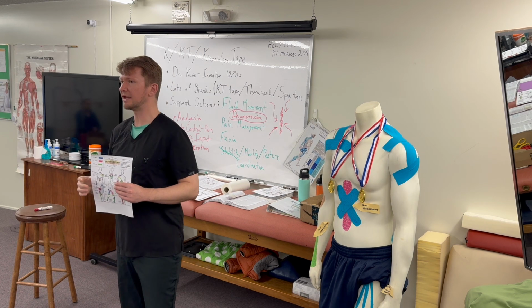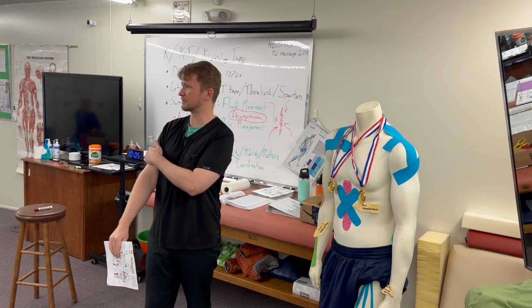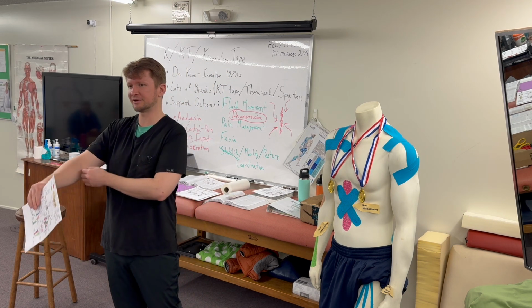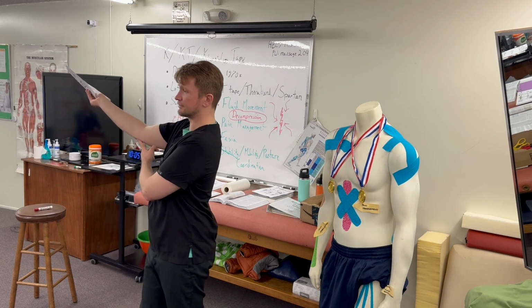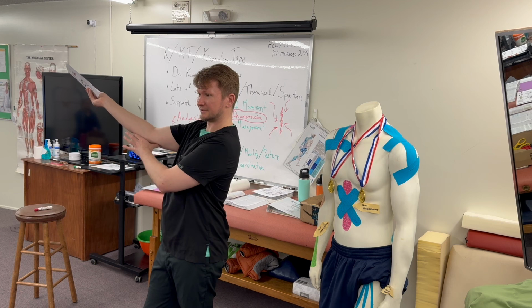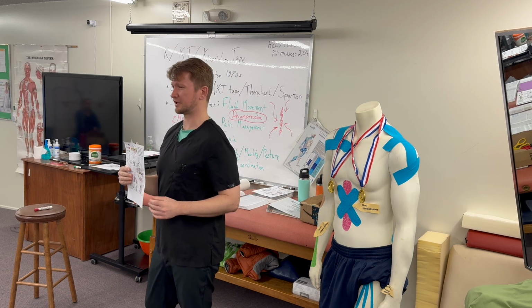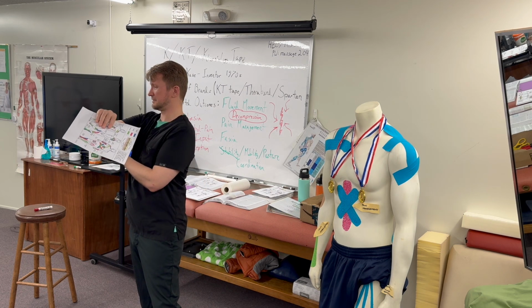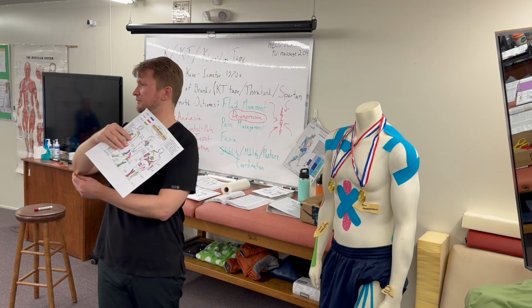So you may find somebody that has what we'll call a hot spot. Maybe there's an area with superficial nerve damage. I've used it when I had any kind of ulnar nerve discomfort. A big piece of tape here. I can be a pretty strong skeptic on a lot of stuff, and it was like, oh, no, that felt a lot better. Just creating a little bit of extra space for that superficial nerve.